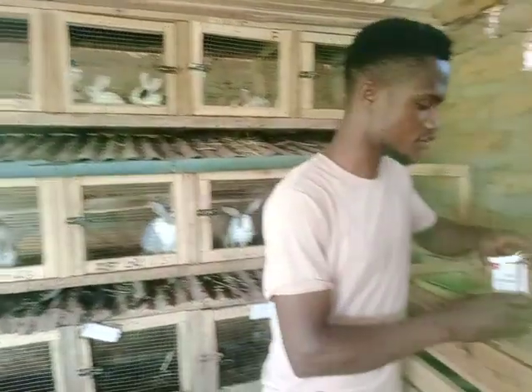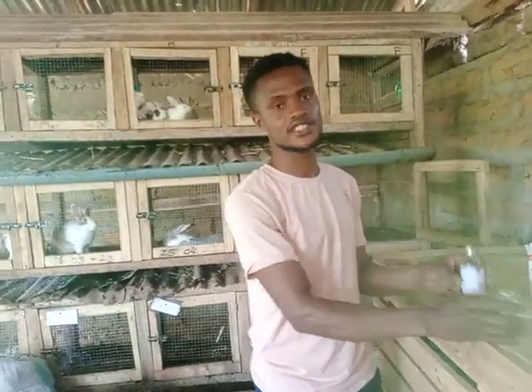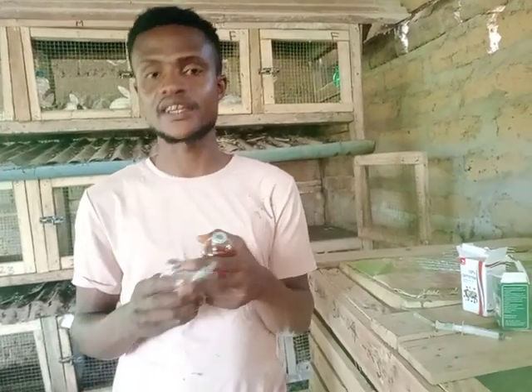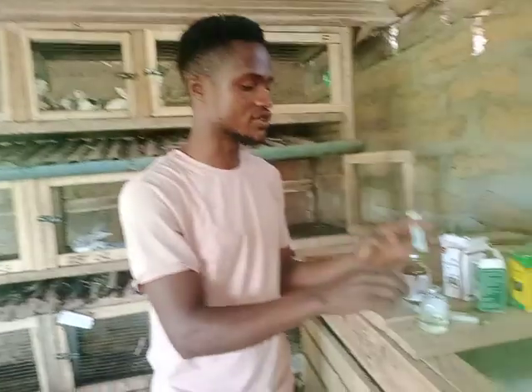Just make sure you have all of these things. But for today, we are only giving them the Oxytetracycline and the Ivermectin injection. So we have three needles here and a syringe.